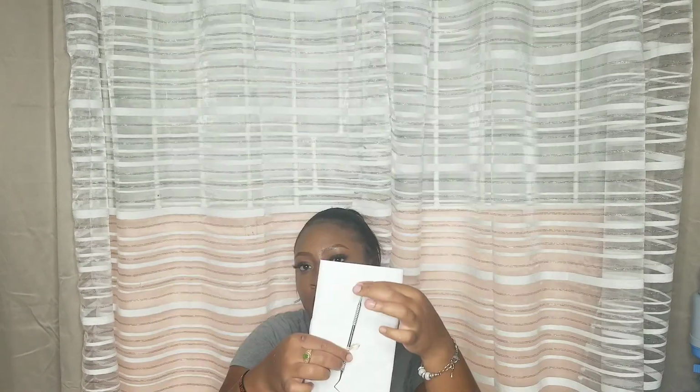You're also going to need an Explorer probe. So this is what it looks like. This end is the Explorer, this end is the probe. What you will be using the Explorer for is to check the smoothness of your preparation once you cut it. And this is used for measurement purposes. So each cavity preparation, there are specific dimensions and measurements that you must use when cutting them. So when you get into dental school, you'll definitely understand a lot more about this.